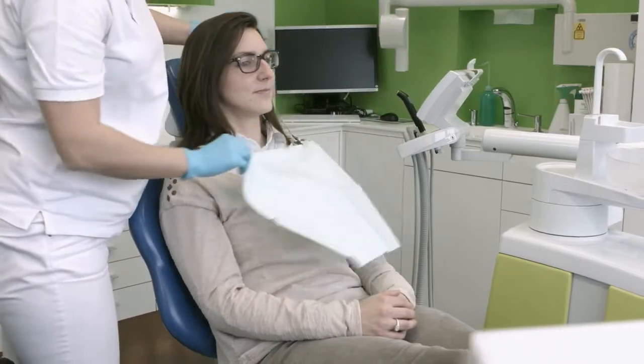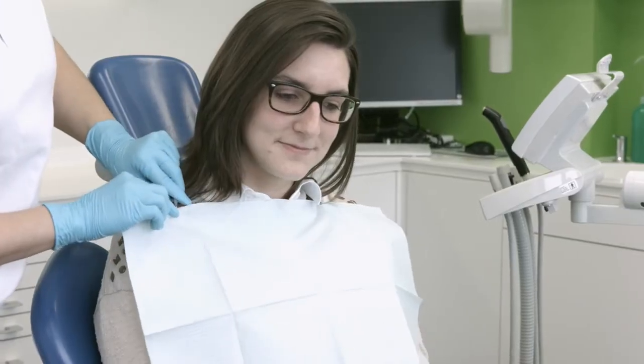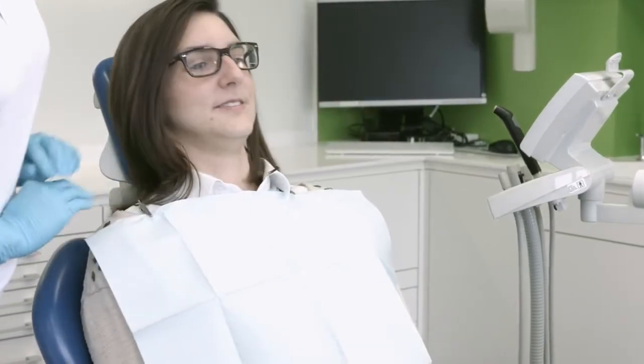Professional tooth cleaning with, for instance, Proxite ProfiPastes is recommended before in-office application of a fluoride-containing protective varnish such as Floor Protector S.